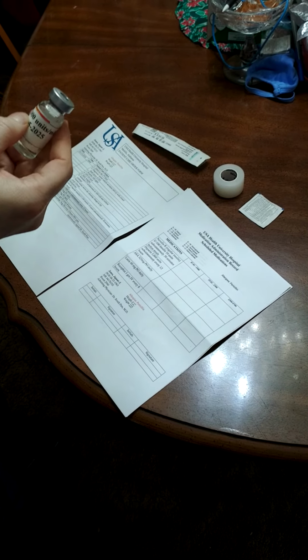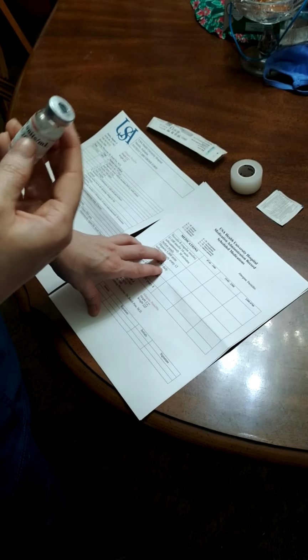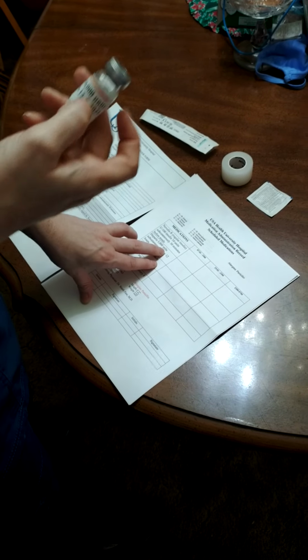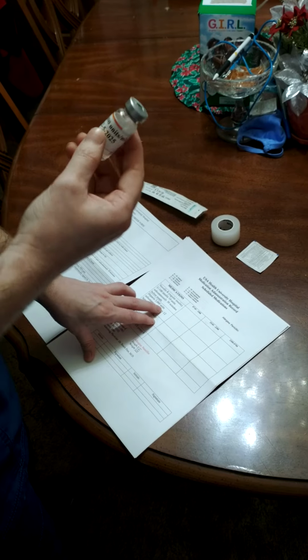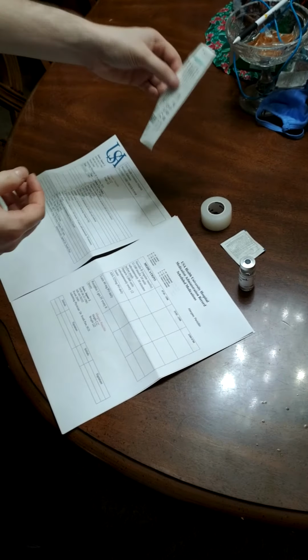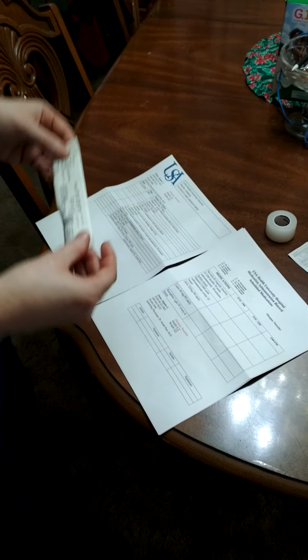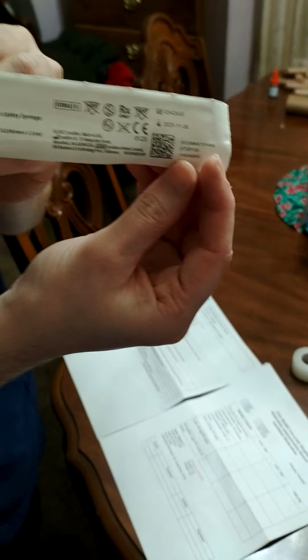So with this vial, we have 10,000 units per ml. And with our medication record, we need 5,000 units. So I will be drawing up 0.5 mLs. For our correct route, since it's subcutaneous, we'll use a tuberculin syringe. So this is a 28 gauge, 1/2 inch needle.